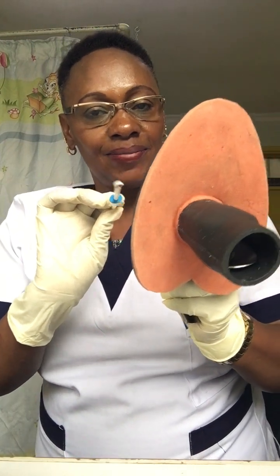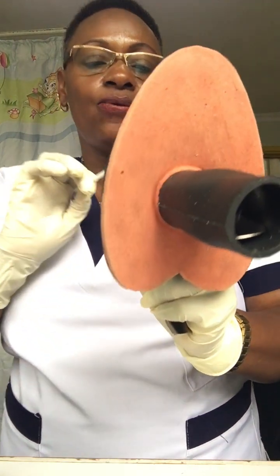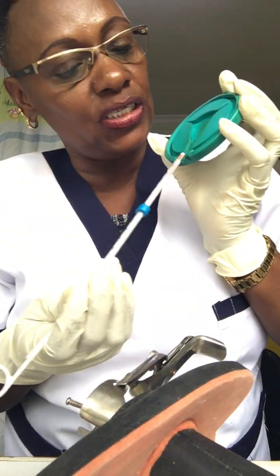And then the other procedures take place before insertion, to make the environment conducive for this one to get inside. I told you first we sound the uterus to measure it, to see if you are a candidate to use this or not. If you're not, you don't go home without a method. You can get any other method. So we insert like this until we reach the tip. This is the tip of the cervix. Now we're still continuing. The tip is here, so we continue here.